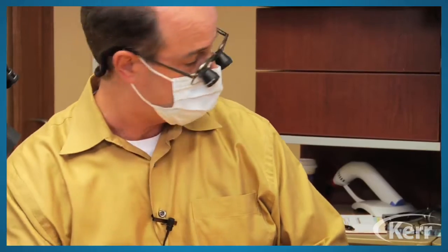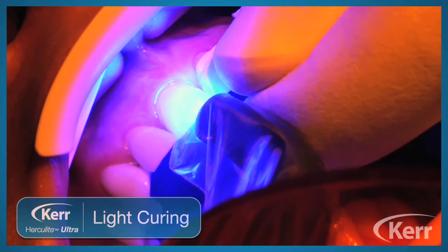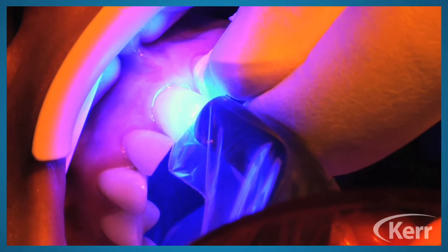So that was Optibond Solo Plus that we just used there. Now we blew that. So the Optibond Solo Plus is a total etch, one bottle system. So it has the primer and bond in it. And that's why you need to blow it. You need to blow the solvent out of the primer.